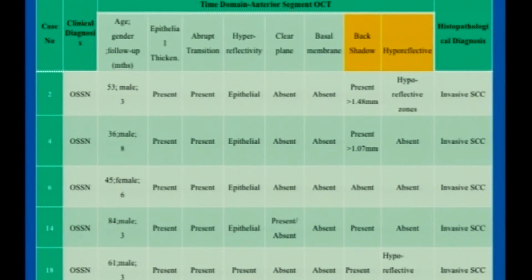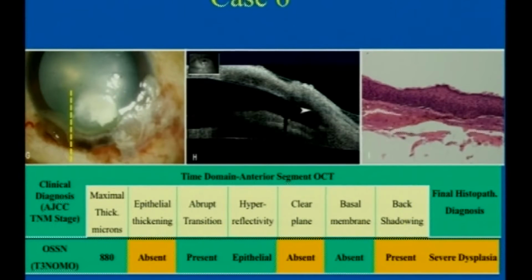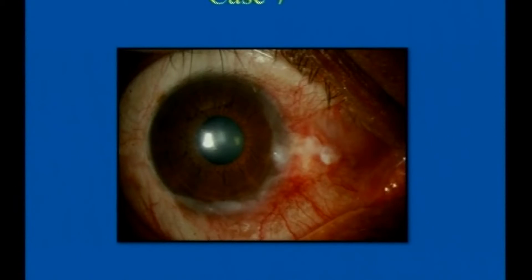We had 6 patients who had invasive lesions, and these hyporeflective changes were seen in several. And the big thing, of course, was that the mean thickness of these lesions was significantly higher compared to the others. Here is a leukoplakic lesion, where the dense shadowing that you see did not allow resolution beyond a certain depth. So that was a limitation. In leukoplakic lesions, it becomes difficult to get good imaging characteristics.